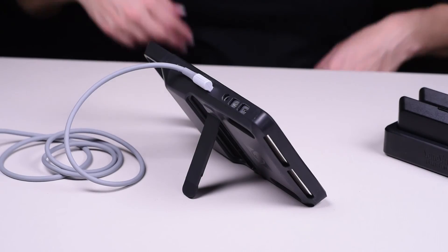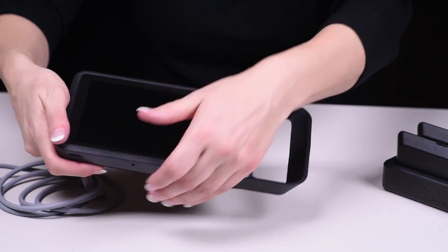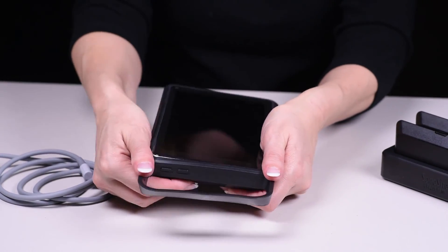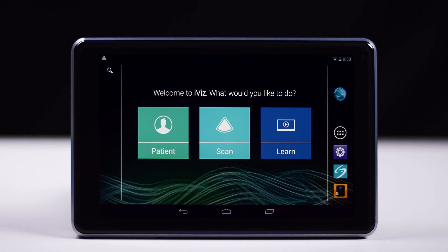To remove the case, unplug the transducer. Then bring the case ends back over the system and lift the system out of the case. For more detailed information about setting up and configuring iViz, refer to the iViz User Guide.